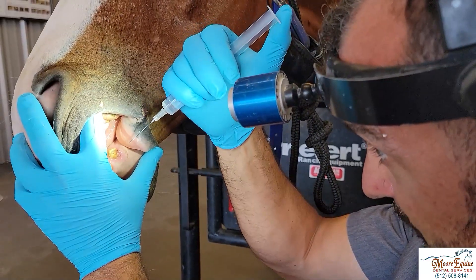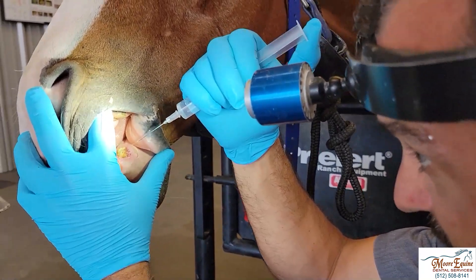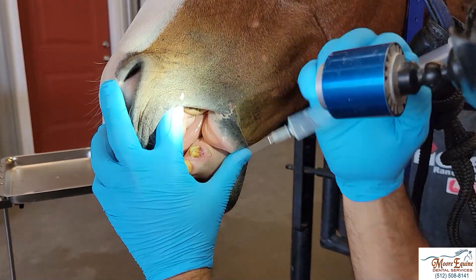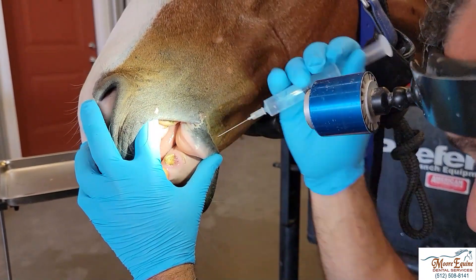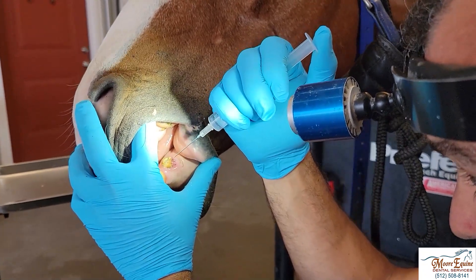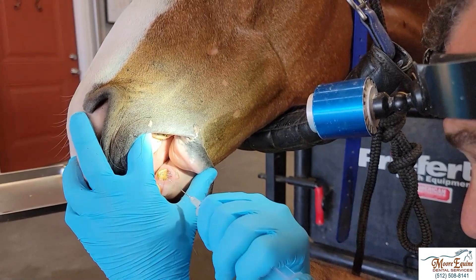Here we've drilled out about five millimeters or so and we're gently washing the canal with saline. You can use very dilute chlorhexidine or other substances, but I like to use this very gentle saline application. Then we're going to dry the canal, put in some calcium hydroxide paste, and seal it with a permanent sealer.